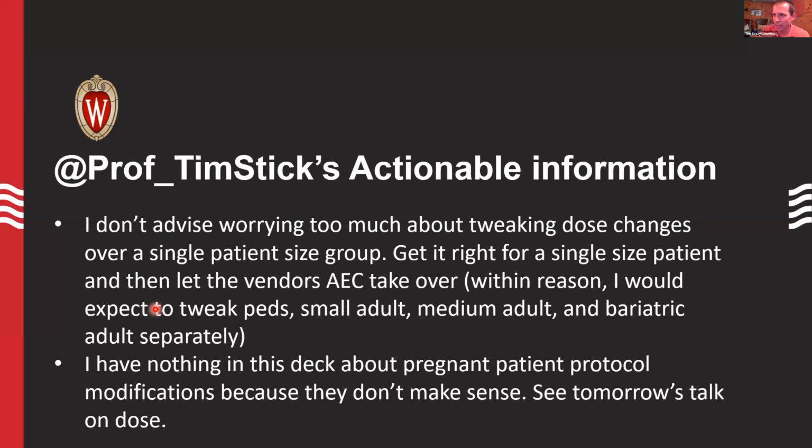So to me, if I already have a starting protocol that's going to work on a non-pregnant patient, that should be as dose optimized as possible. I don't want to do anything different to that protocol and then use it on a pregnant patient, which may jeopardize the quality there. So from a protocol acquisition side, I would not change anything. Now, on an appropriateness criteria, or what's the best modality to image, that's a separate question that I won't get into in this talk. But there'll be some more on this, especially related to PE, because that's a really common indication for the pregnant patient population, which we'll talk about tomorrow.